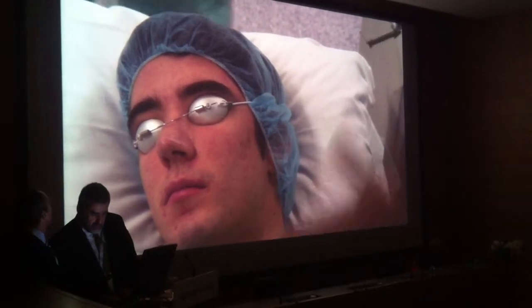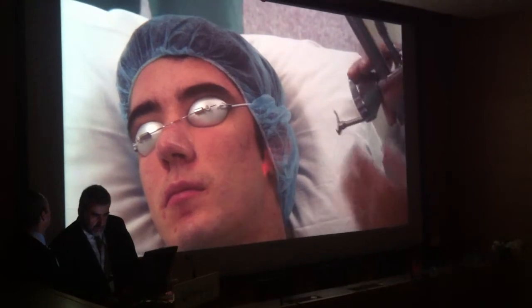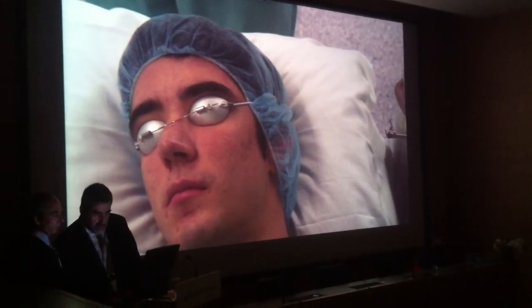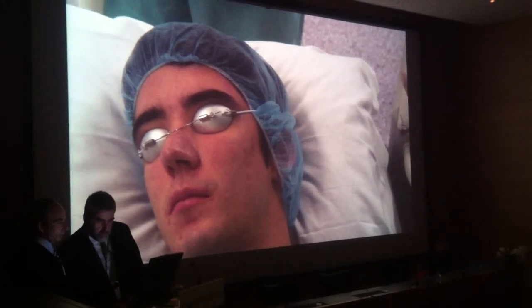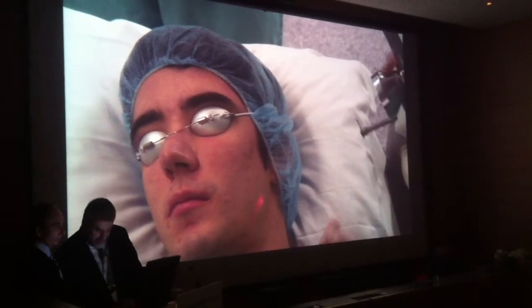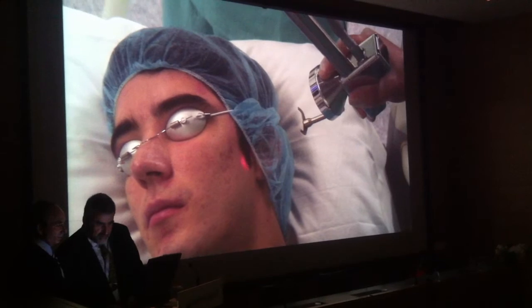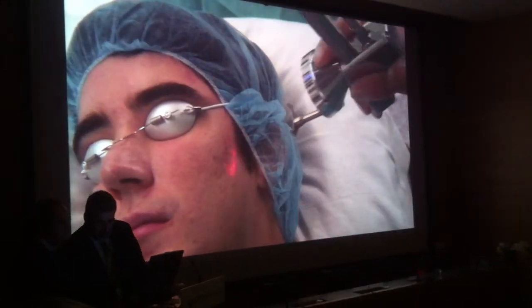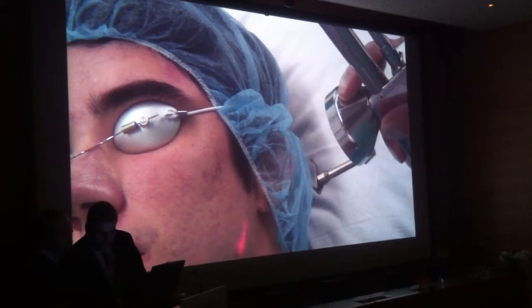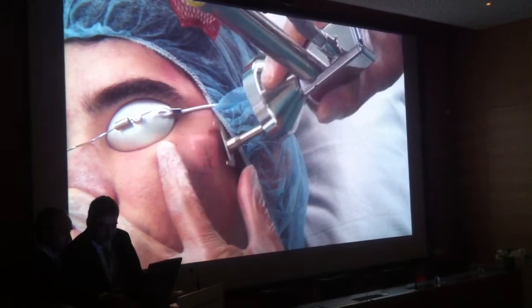I don't have time to tell you all the reasons why I'm doing this, but as far as safety is concerned, this is a very good way to ensure that you're not going to aggravate the condition of the patient, first. And second, it's a very good way to avoid overhydration, because a topical cream will change the absorption of the skin. So here we go now.